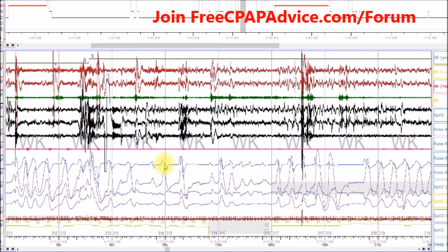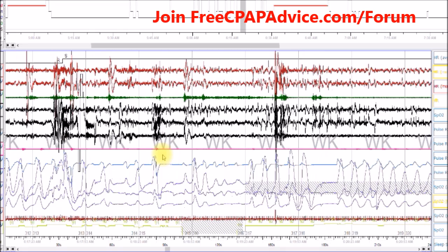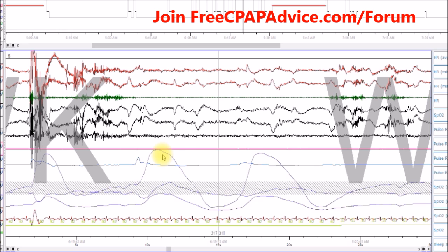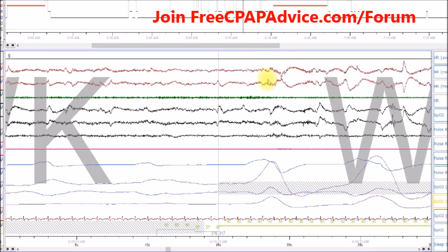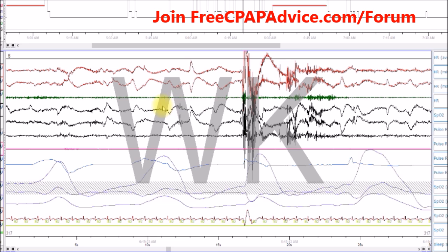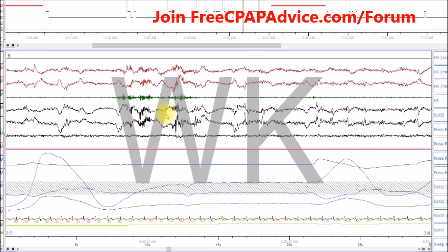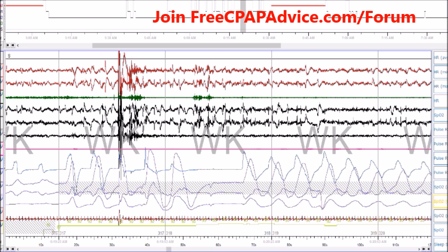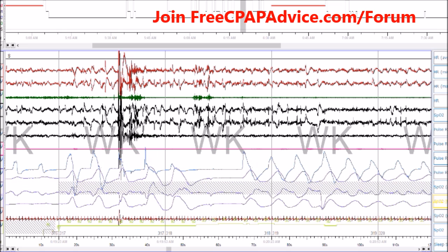You can see right in here - we know that all of this is wake, right? This person is looking around. That is not sleep. You can see the eyes moving, they're blinking right here. It's all thick and nasty - wake, wake, wake, blinking, looking around. If we zoom back out, what does that look like? Well, that looks like nothing.